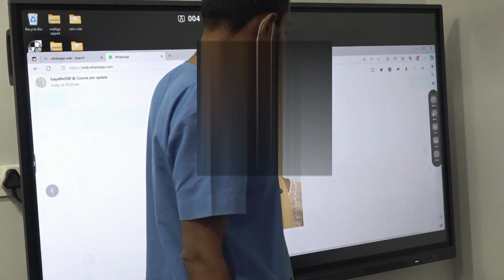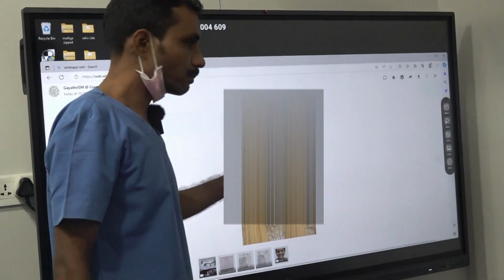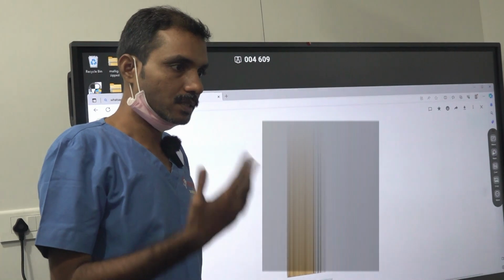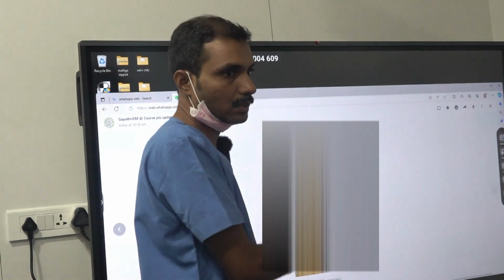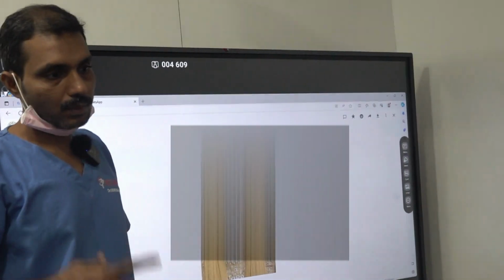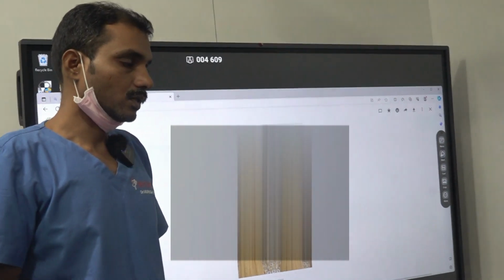This is called dynamic video. So we understand how the lip moves, because one side of the lip may move differently. After treatment the patient may say that only after treatment is my lip going to one side. So we should have this document before surgery, even more important than the smile photo. This video is called dynamic video.